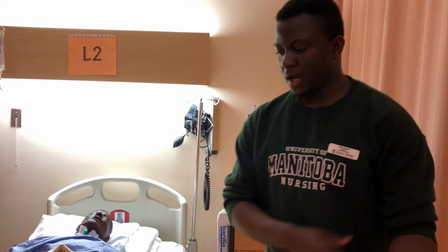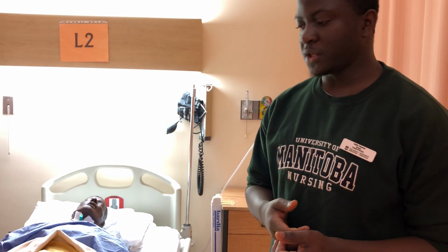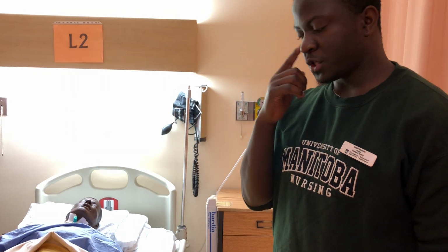Hi, my name is Valdo and I'm going to be showing you how to change a chest tube dressing and to start a heparin infusion on a patient. So I have an order to change a chest tube dressing.